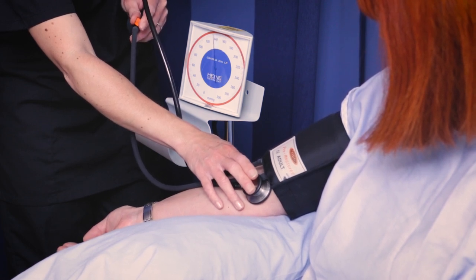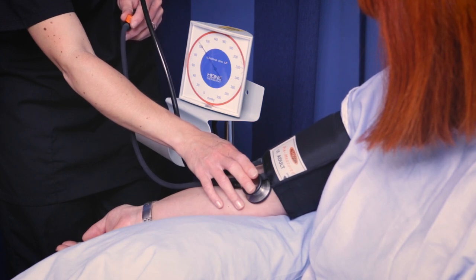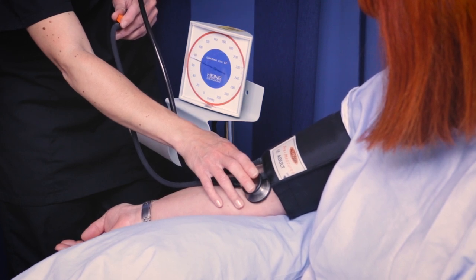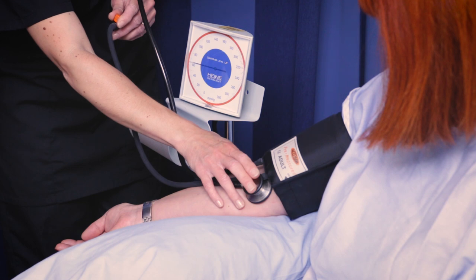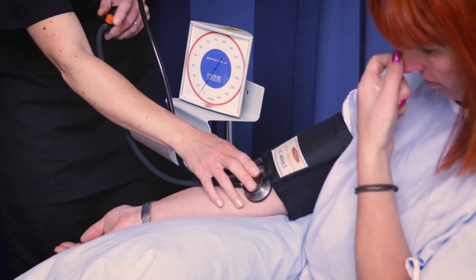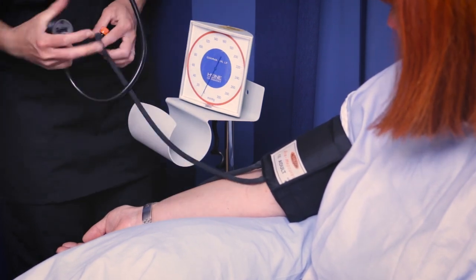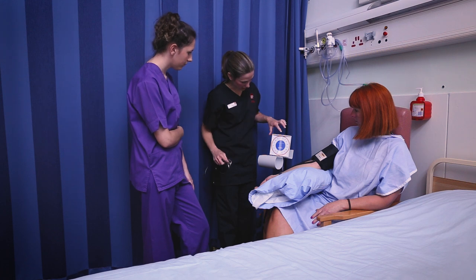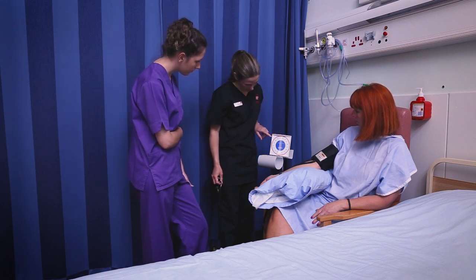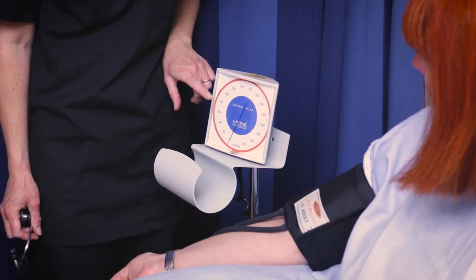This is the hard bit — to let it down very, very gradually. So I could hear the first tapping sound around 120, and the sound disappeared at 78. So that would be 120 over 78 — the blood pressure.